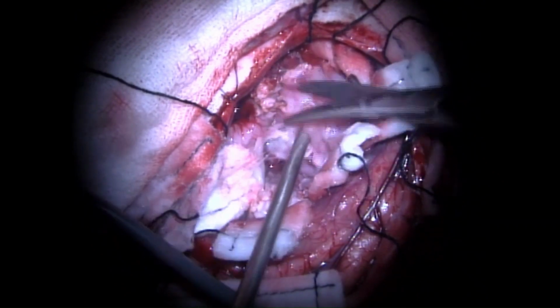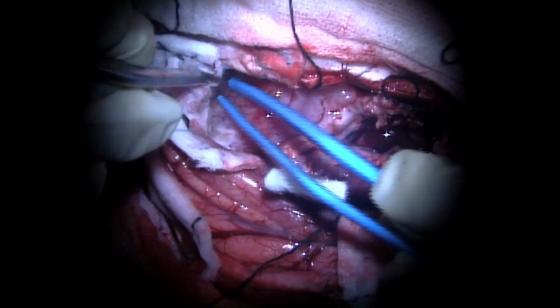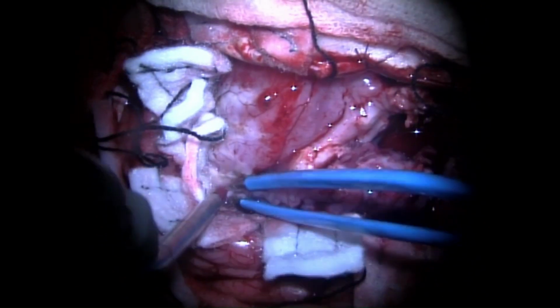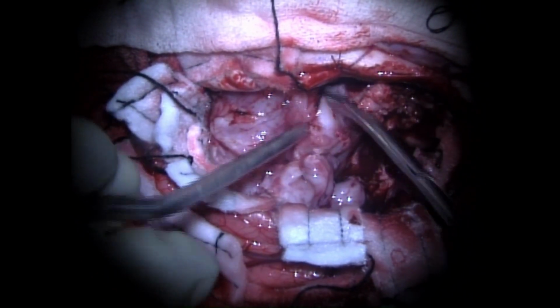A familiar sequence of bipolar coagulation, followed by the use of microscissors as well as larger Metzenbaum and Mayo scissors to remove this large ugly tumor in a piecemeal manner.